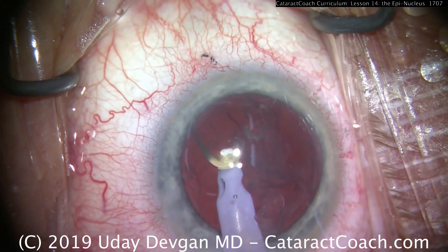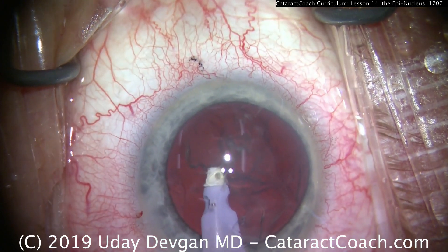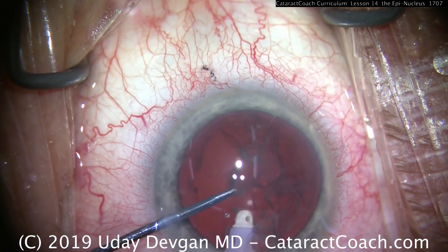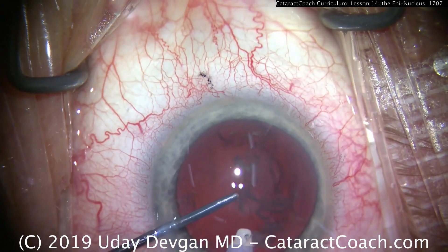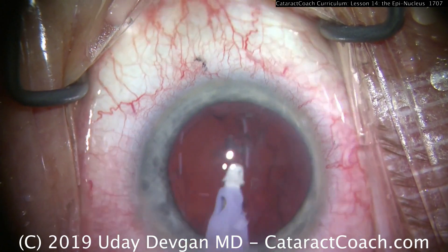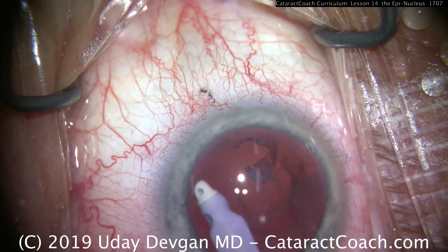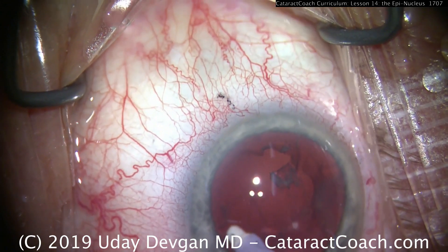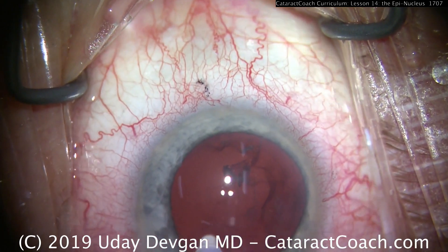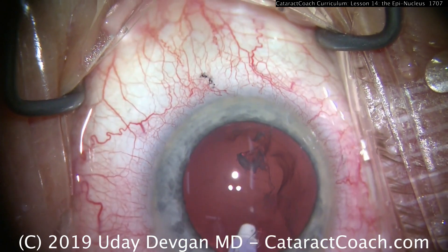Here we've switched to the IA probe and are getting the last bits of the epinuclear shell. If it's a denser shell like this, it may need that spatula or second instrument to help push the pieces down the port. Always, the epinuclear shell can be removed with either the FACO probe or the IA probe. The FACO probe is faster, but the IA probe provides a little bit more control, and that can be helpful. We're not looking for speed — we're looking for the best and safest surgery possible to give our patients the very best vision.